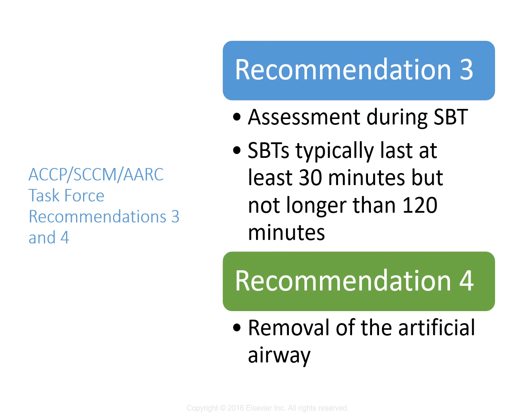Recommendation number 4 here is removing the artificial airway. Yay, right? For patients, when the support from the ventilator has been successfully discontinued, obviously the big question is, should we remove the artificial airway? Is there patency of the airway? Should we have trauma anesthesia on standby, especially if they had a traumatic intubation attempt or a difficult airway, right? Or should we extubate over a bougie or a tube changer? Should we make some other things available if we're going to do this?